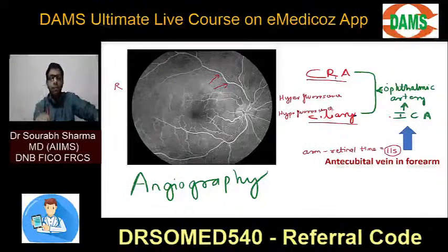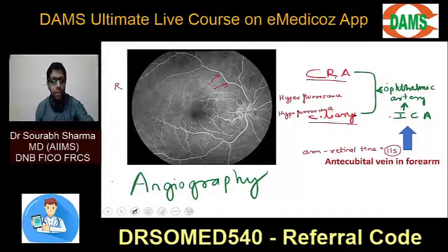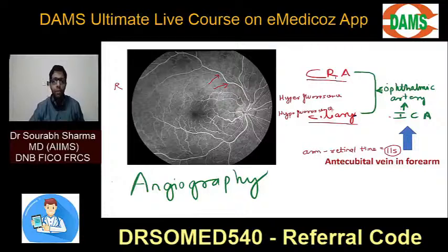Now tell me, why is this dye from the retinal vessels not coming out of the vessels? Because of the inner retinal barrier. And can you appreciate, behind the retina there is choroid, there is diffuse choroidal dye there.